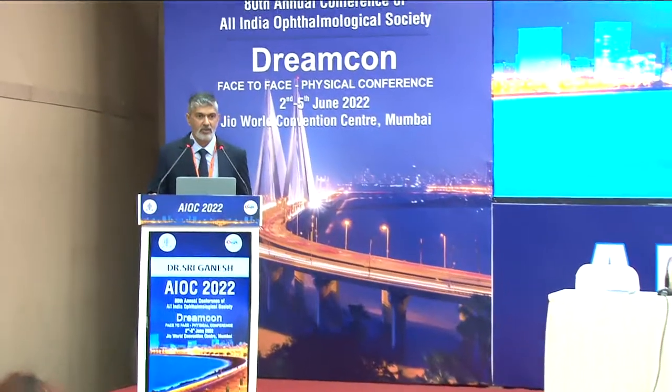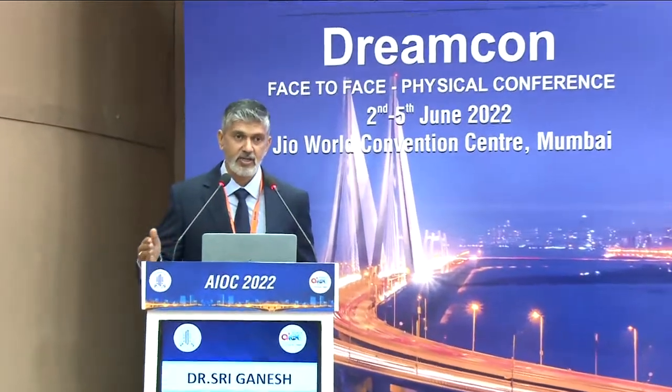There are also studies which have looked at the false positivity, specificity and sensitivity of the Pentacam. So you can have a high overdiagnosis; the specificity is about 67% or something like that. If it says it is normal, that means it is very unlikely that it is an abnormal cornea. But if it says that it may be a keratoconus cornea, there is almost a 33% chance that it can be normal. And this is not only for small corneas, we see it on average corneal diameter. So this is something that you have to take care of.